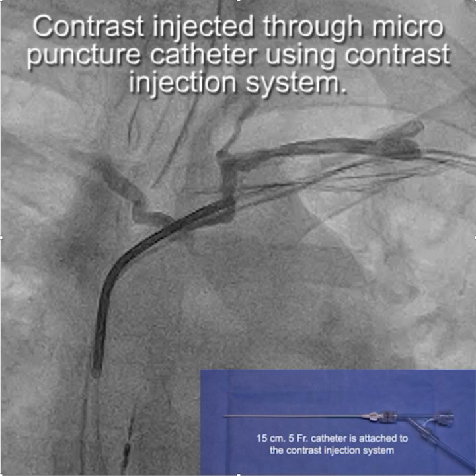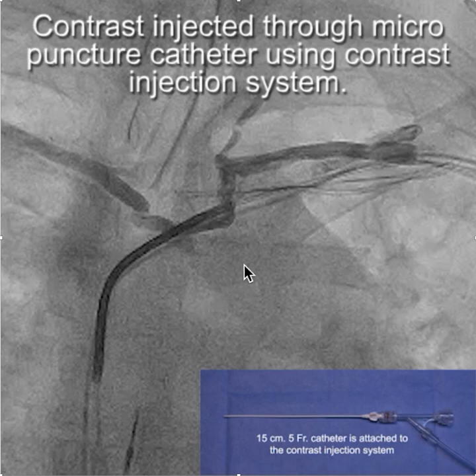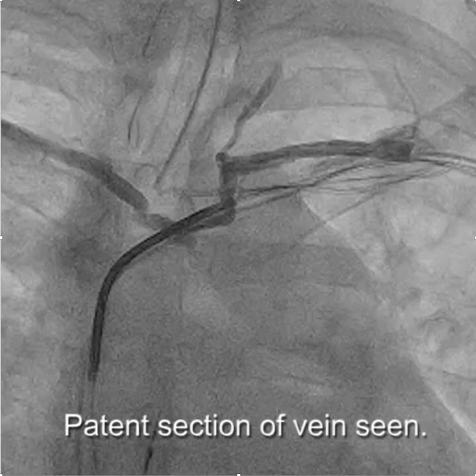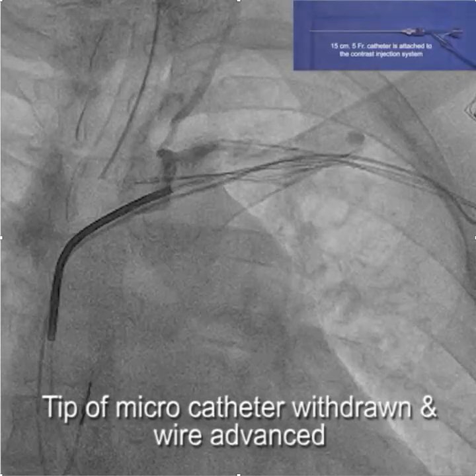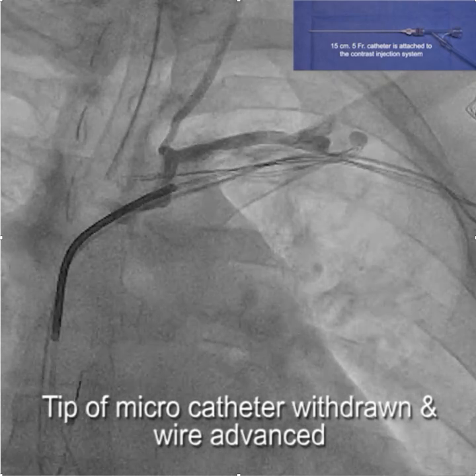If you just focus on this area, it looks like there's a total occlusion and it's not going anywhere. But if you pay attention down here, you can see contrast following another route. So what we're going to do is — with the tip of the micropuncture catheter — gradually back that up to the point where we can see if we can get into the other channel.